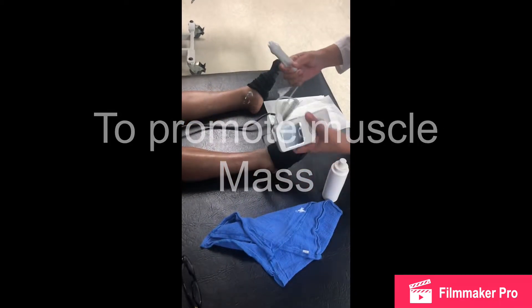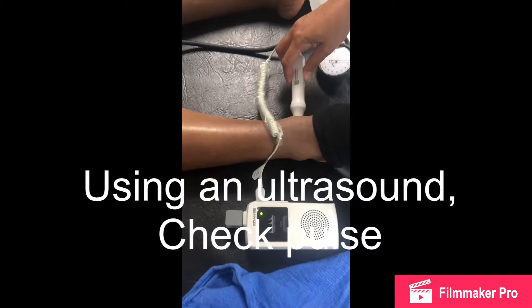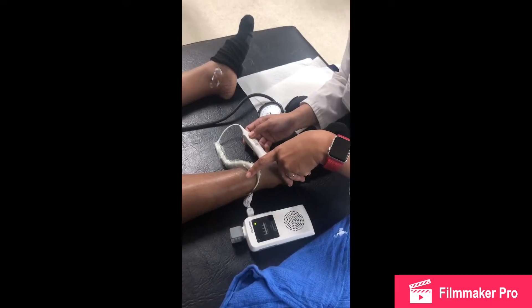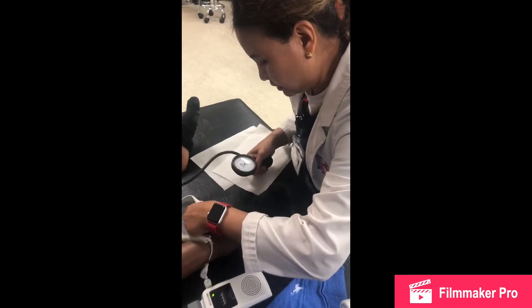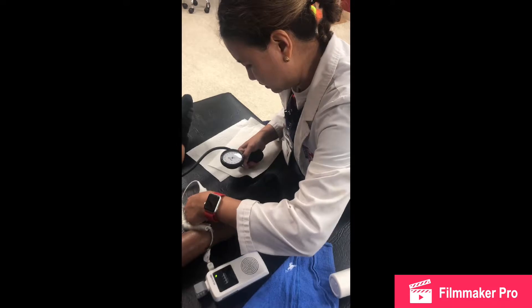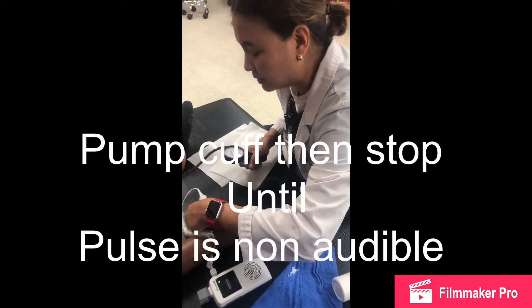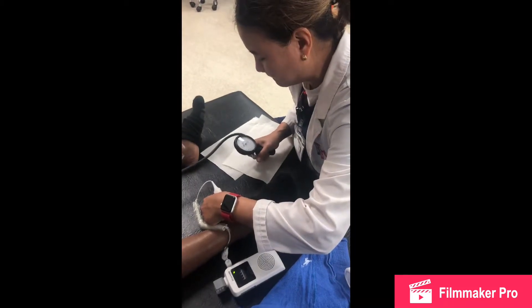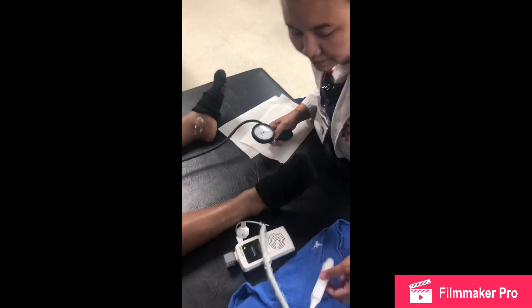What I'm doing right now is checking the pulse. The cuff is a little bit deeper than the other. We're pumping until the pulse is diminished or gone. There you go — we're going to stop here. That's when it stops.